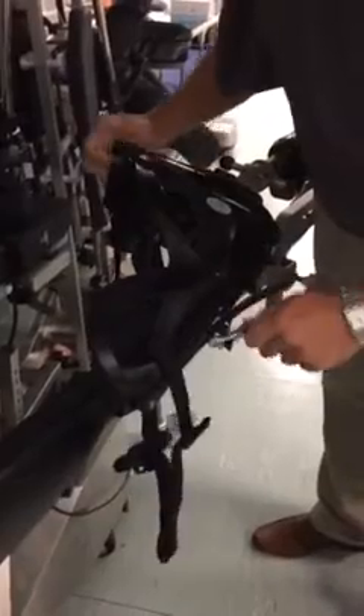Now if you come on the back side, what you see is this action here pulls the center strap down.